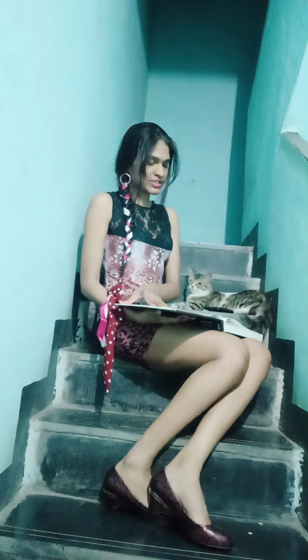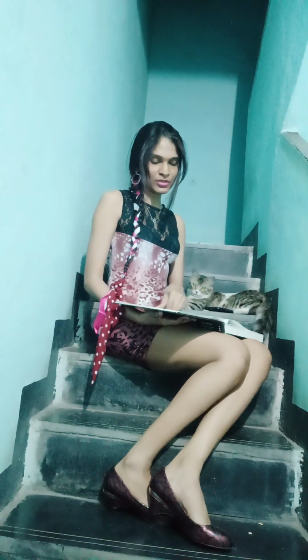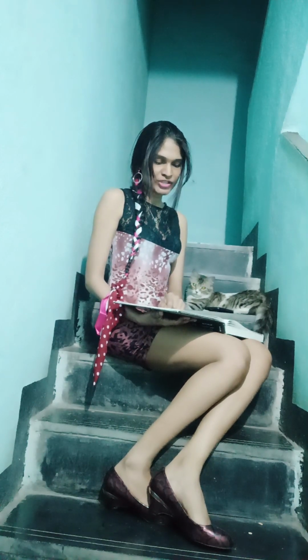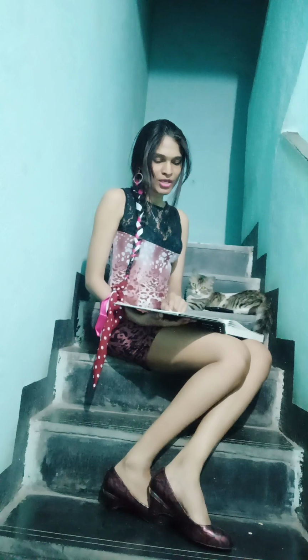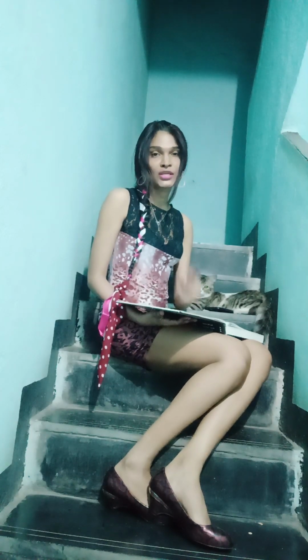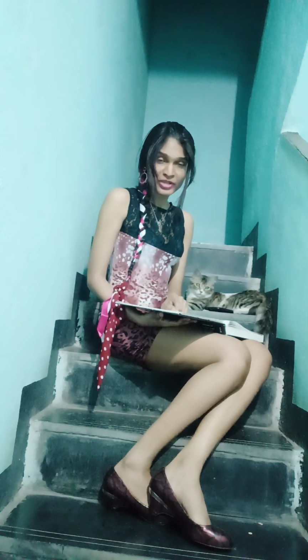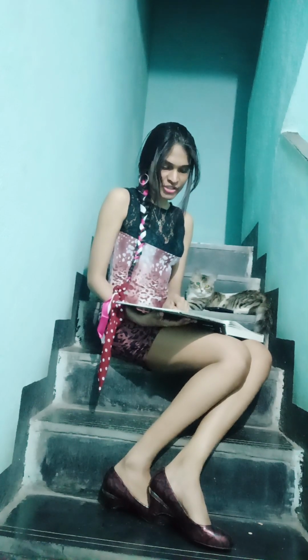The critical angle for the cornea-air interface is 46 degrees. In figure E, you can see the direct gonioscopic lens principle. You can see here the light rays coming from the anterior chamber angle. They are not refracted at the cornea and contact lens interface because they both have a similar refractive index, and that's why these rays undergo minimal or no refraction here.